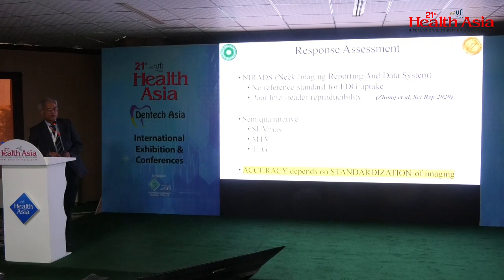This is very important because if the baseline and follow-up images are performed with different imaging parameters, then the precision will always be compromised, because FDG uptake depends upon so many confounding factors, starting from the fasting blood glucose level to the calibration of the PET-CT scanner.